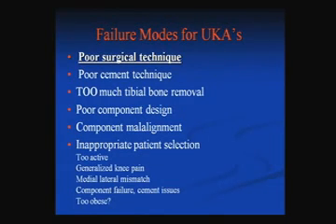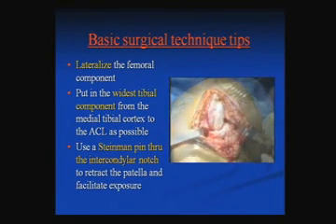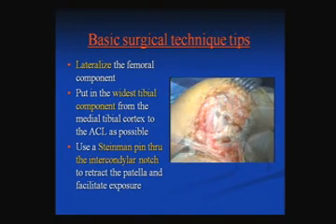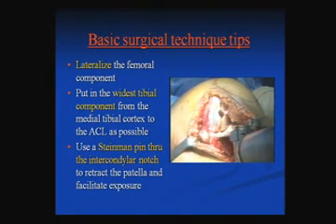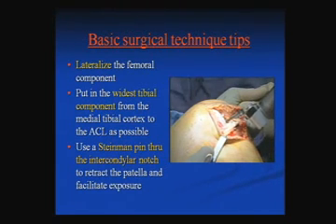The failure modes for these, I think, really tell you a little bit about what you need to do to make it successful. And poor surgical technique is right at the top. You have to lateralize the femoral component, put in the widest tibial component possible from the medial tibial cortex to the ACL. I use a Steinmann pin through the intercondylar notch to retract the patella and facilitate exposure.